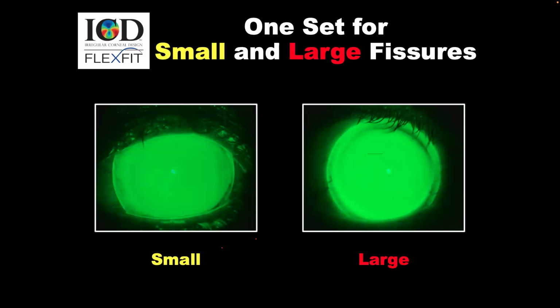I fitted one patient with a really small eye aperture, and it was tough. I don't remember if it was a 16, but he actually managed to do it by his own means. We have the ability with this lens, and sometimes I wish I had a small scleral lens, like a mini scleral lens, for that patient in particular.